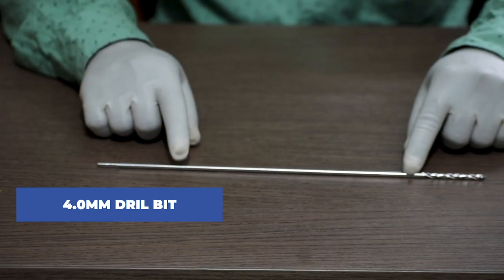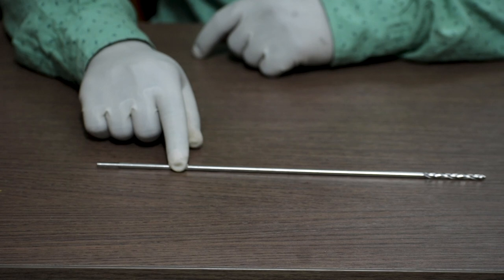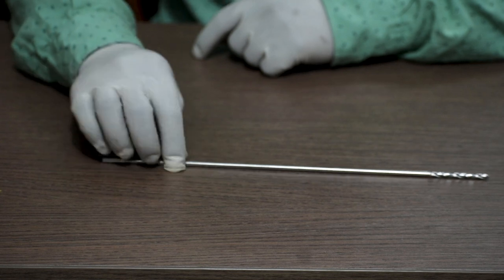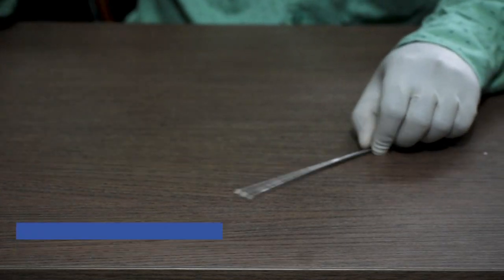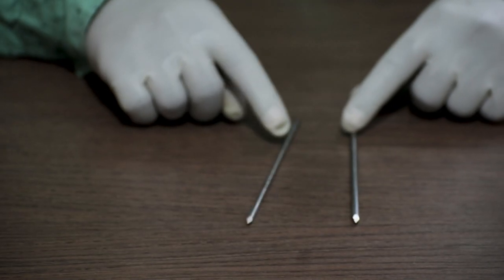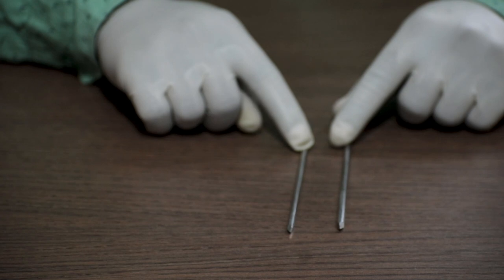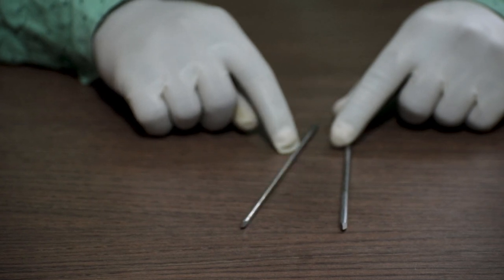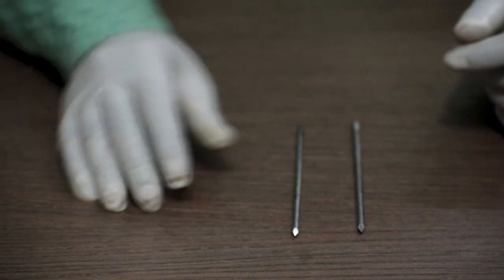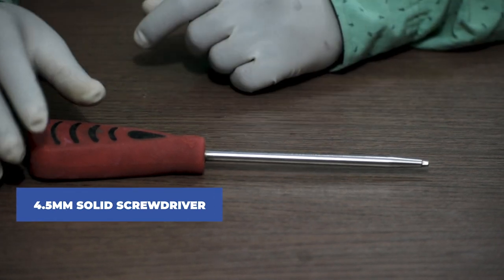Next, the 4 mm drill bit, generally available in a length of 300 mm. Next, Steinmann pins, given in two sizes: 3.5 mm and 4 mm, generally available with a length of 150 mm. Also included is a 4.5 mm solid screwdriver of 150 mm length.